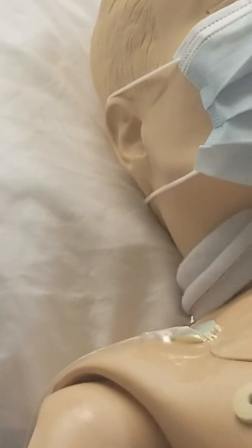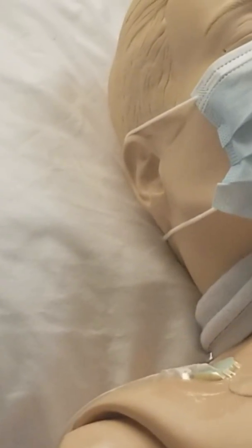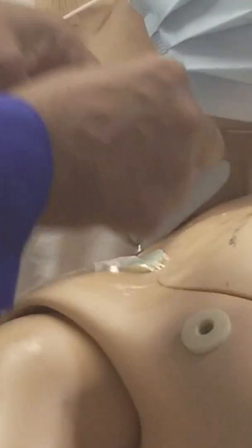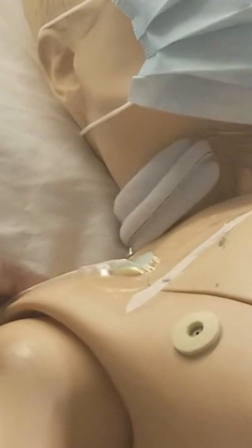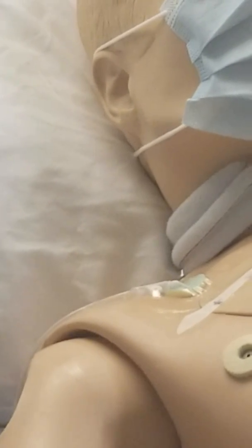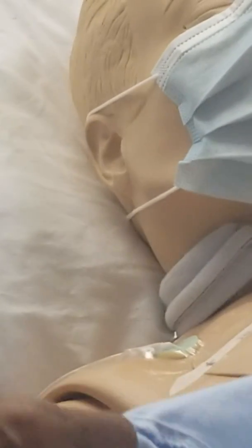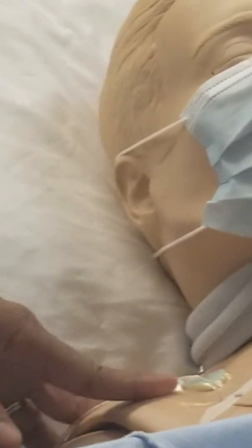Go ahead and sign and date it. Make sure when you put this thing on, you don't put it over the site, okay? Make sure you leave it so the next person can see the site. Because some people put it just like this. You can't, so you need to put it off to the side. Put it down here, sign and date it, okay? Sign and date it, wash your hands. You can take your gloves off, you can take your mask off. Go ahead and you got to do your documentation, but that is how it should look when you finish, okay?